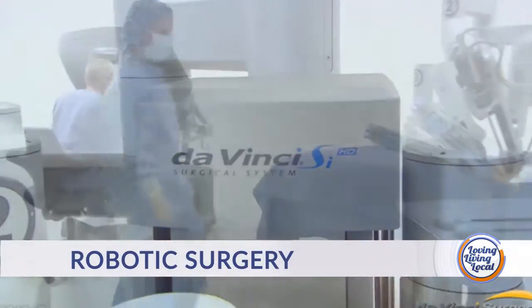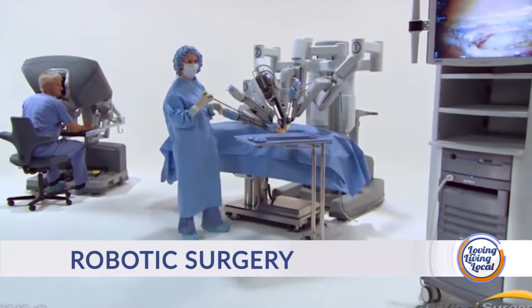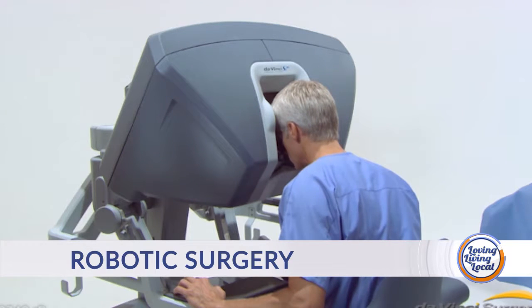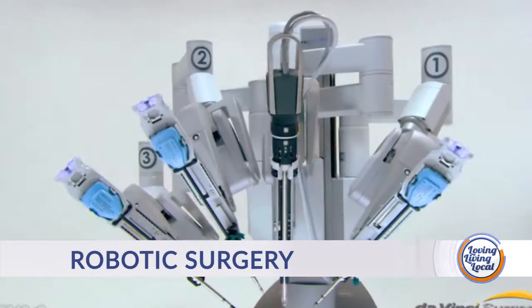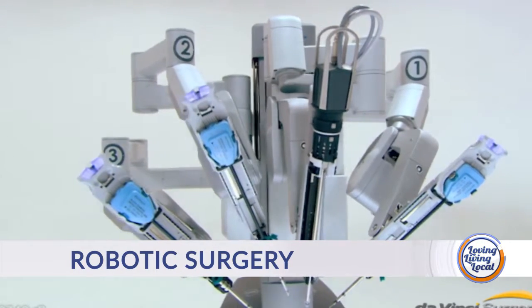All right, we're talking about robotic surgery when it comes to urology, correct? And it seems like robotic surgery really is becoming a thing nowadays, right? That's correct. So what is robotic surgery? Robotic surgery is a type of minimally invasive surgery. Minimally invasive surgery means that the surgeon, instead of operating through large incisions on patients, operates using miniaturized instruments that fit through a series of small incisions, a 1/4 inch size. And during a robotic operation, the surgeon uses master controls to manipulate the instruments.